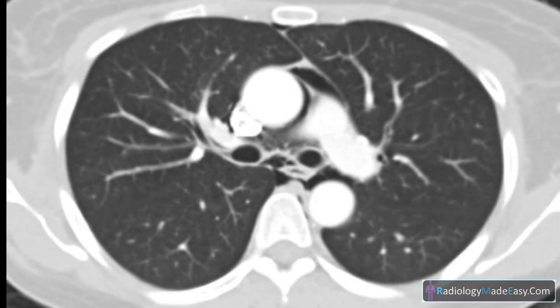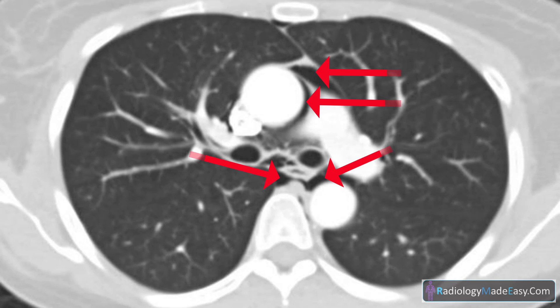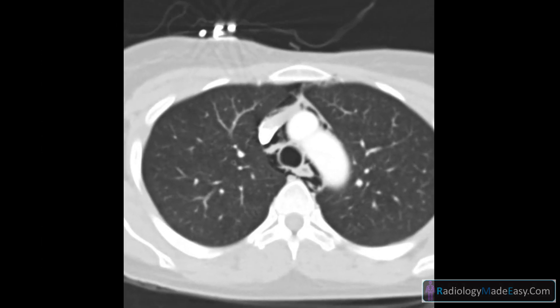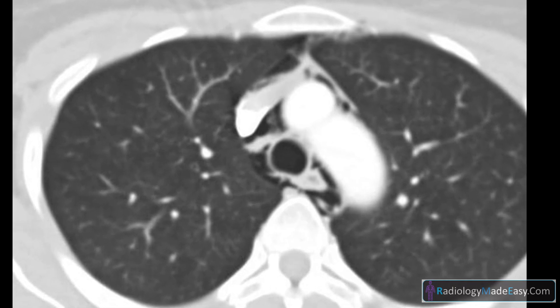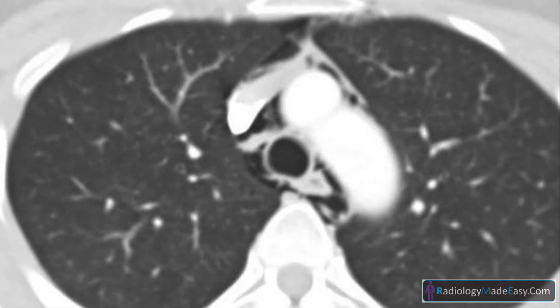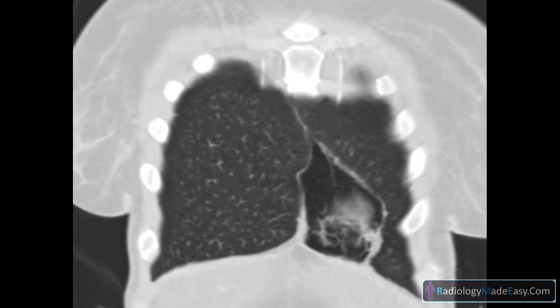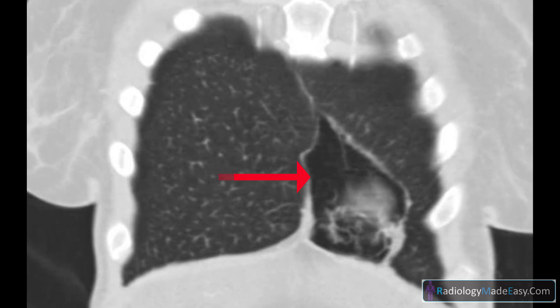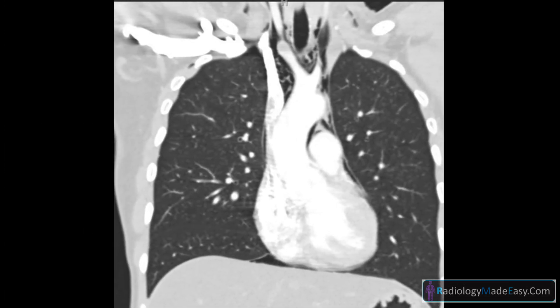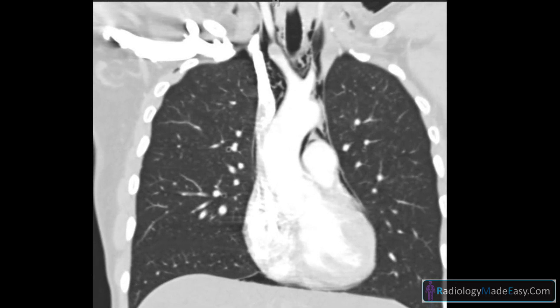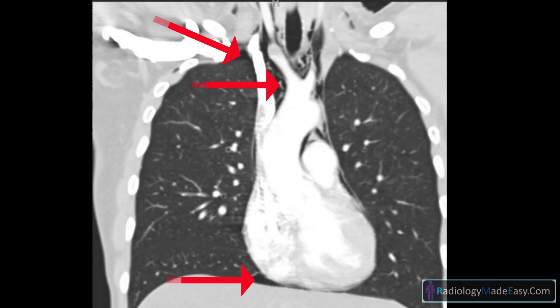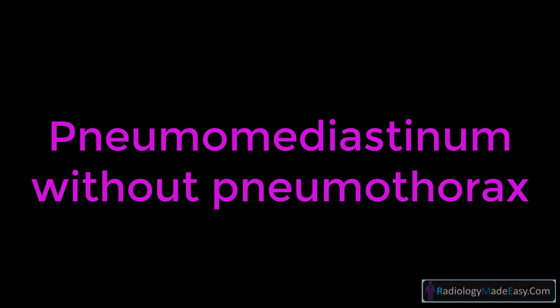Here you can see an extensive amount of air in the mediastinum outlining the thymus, the esophagus, and also around the SVC. The diagnosis is pneumomediastinum without pneumothorax.